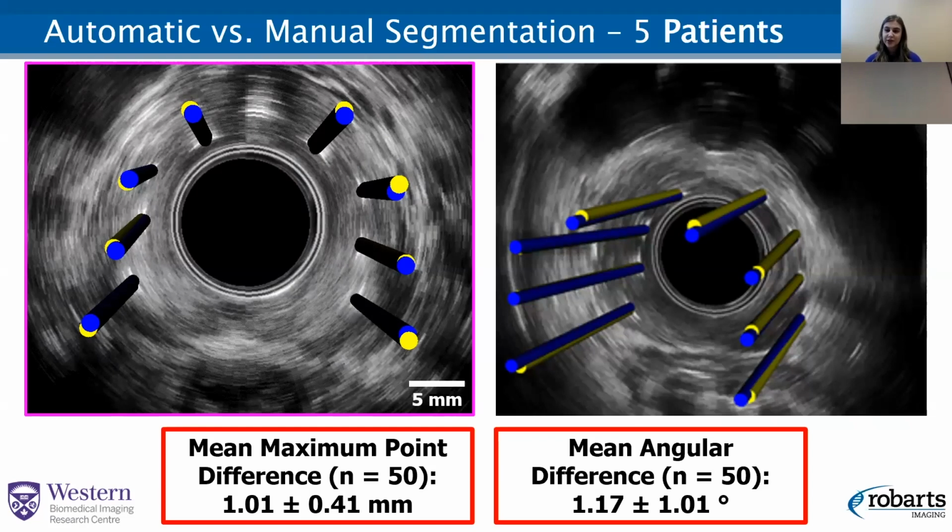And so again, we felt that this was adequate to give an idea of the quality of the interstitial implant in the intraoperative environment, with the 3D approach taking about 30 seconds to give the output of needle localization. And so we felt that adding these tools would really improve the clinical translation of this system. And the other aspect that really helps with the clinical translation is the versatility of this approach.